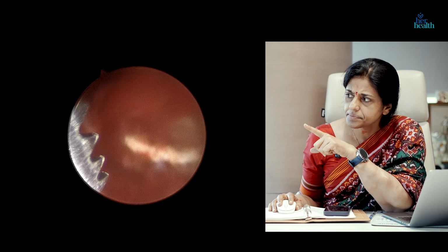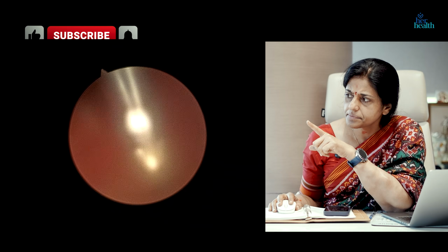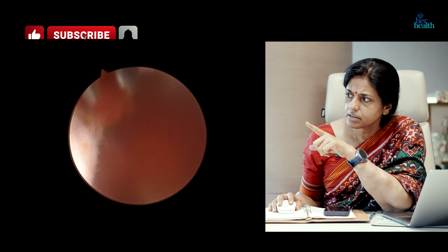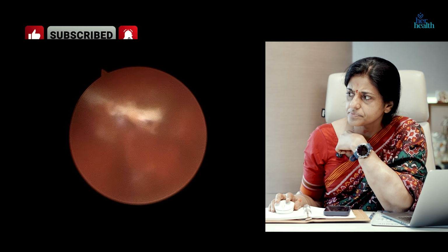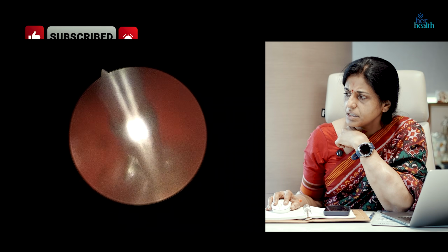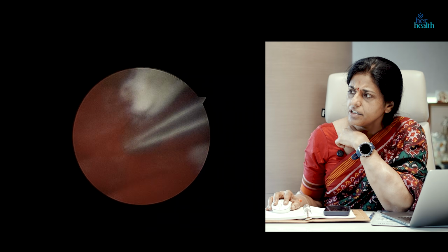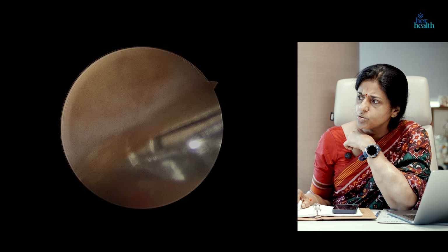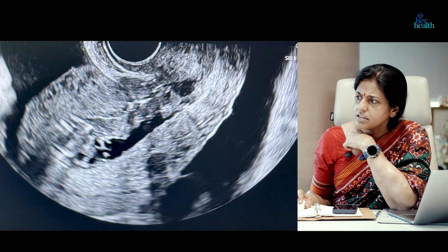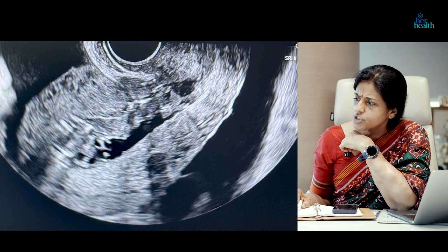Open the jaws, try to grasp it at the widest part and bring it out. Sometimes if the bone is very flat, it is little tricky, but here you can see this is the main part of the bone that was, and this is the post-operative ultrasound. So you see the cavity is nicely distending. There are no bony tissues anymore.